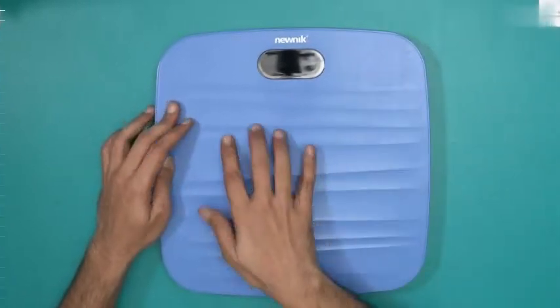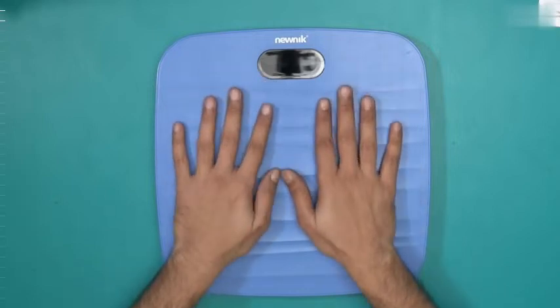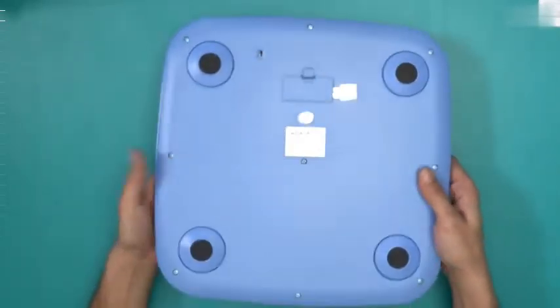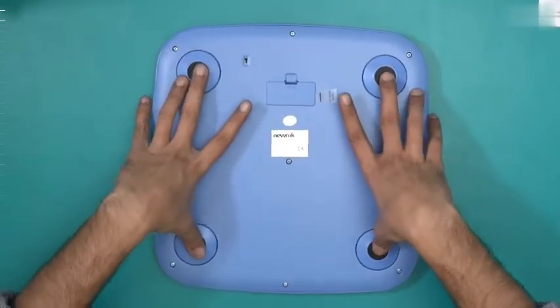This is the blue variant and it has a striation on the surface, just to give you comfort and a solid grip when you stand on it. Let's take a look underneath — it's also blue in colour, and these are the four anti-slip rubber stops.